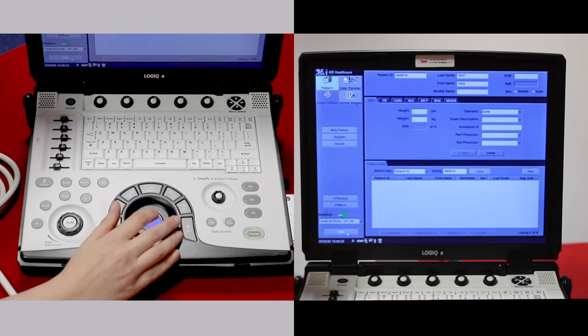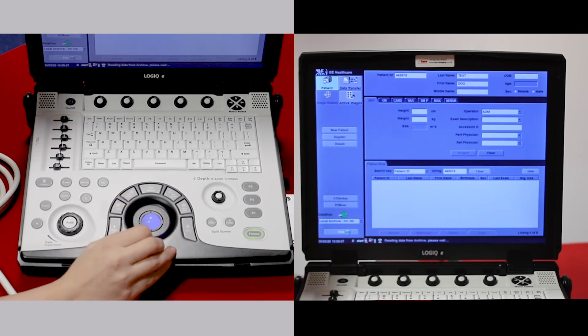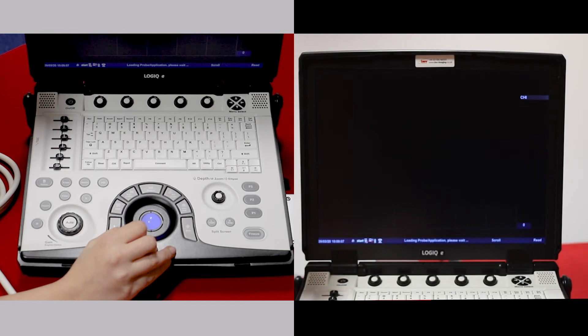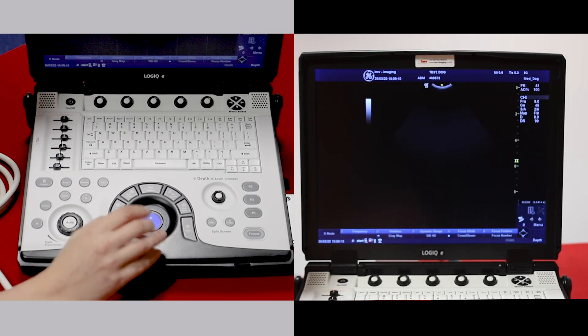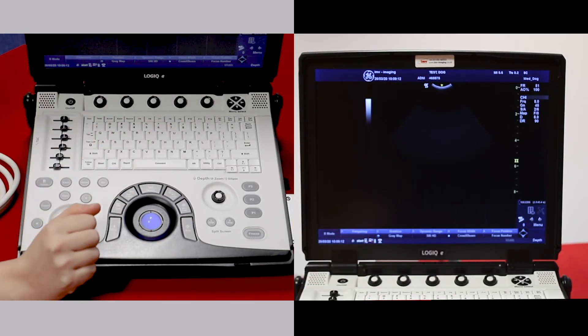Then down at the bottom, we can exit, and then our patient name has appeared at the top of the screen.